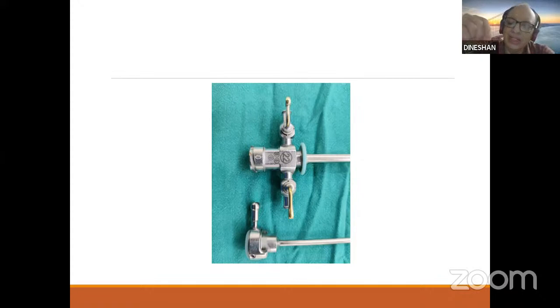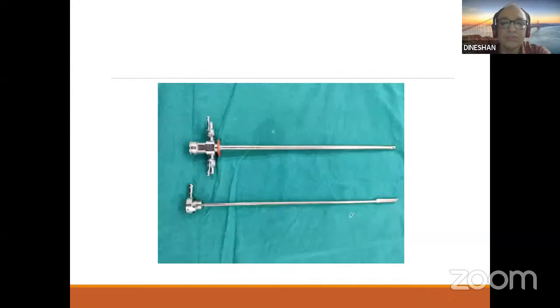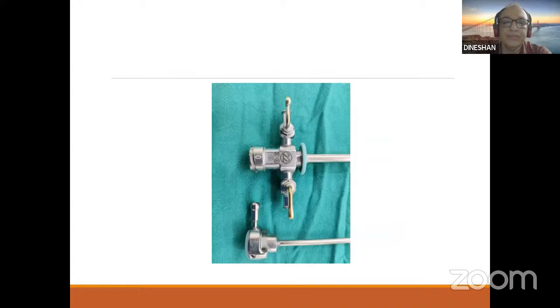Either any ureteric catheters or any other accessories, you can pass 2 simultaneously. This is the largest size, and the other 9 you can see here. That is a single large equipment, the largest single equipment which can be passed through the working channel. And you can see the color coding also.